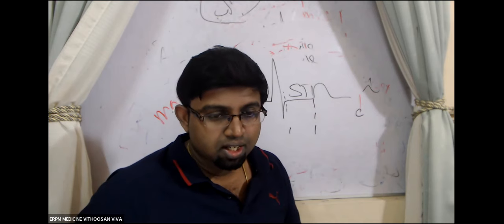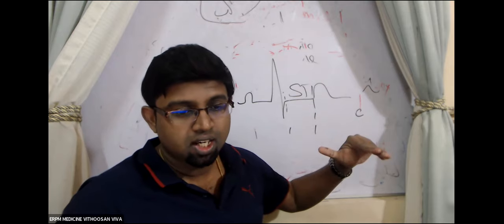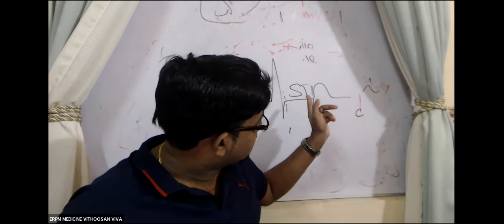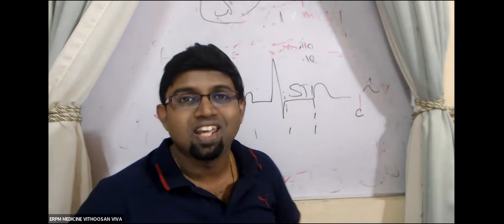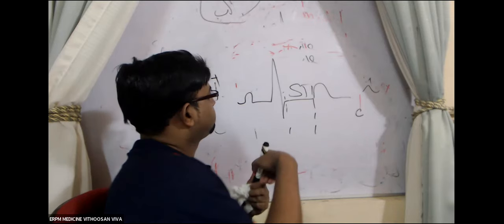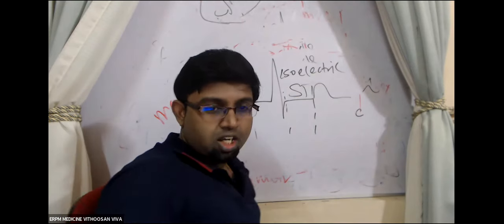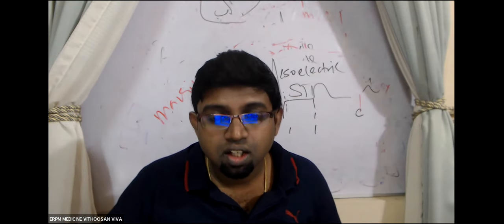In a normal heart, this ST segment should be isoelectric. What do you mean by the word isoelectric?